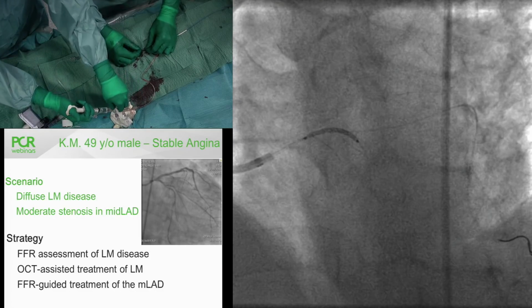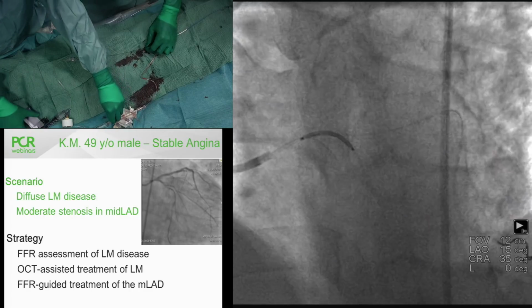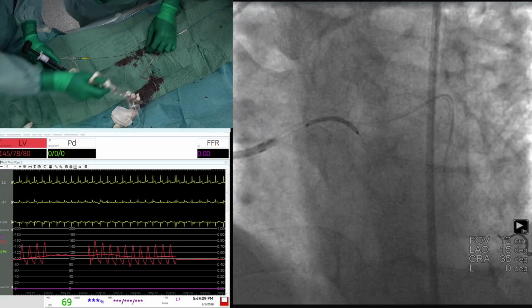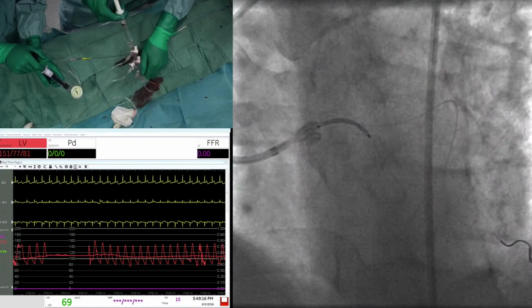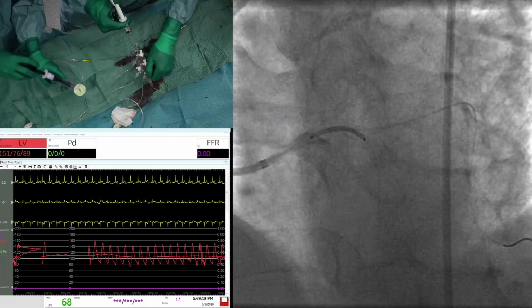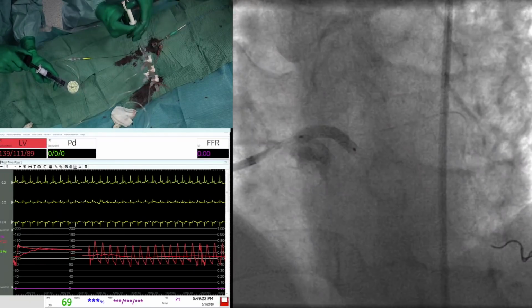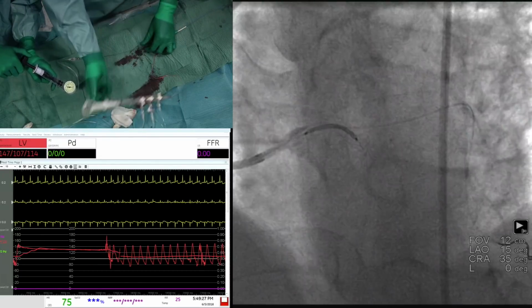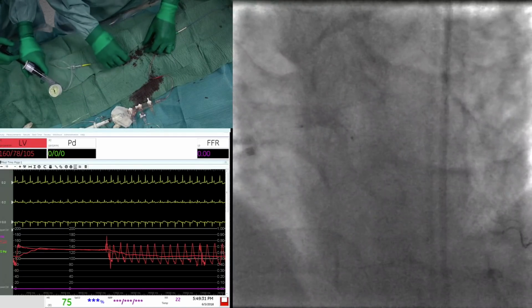Yeah, very cranial. Yeah. It's not too bad, huh? That's not too bad, no. Yeah, still okay. There will be some part protruding, but okay. No problem. Okay, so I'm going to film, just to inject. Yes, inflate. Yeah, I think it's okay.